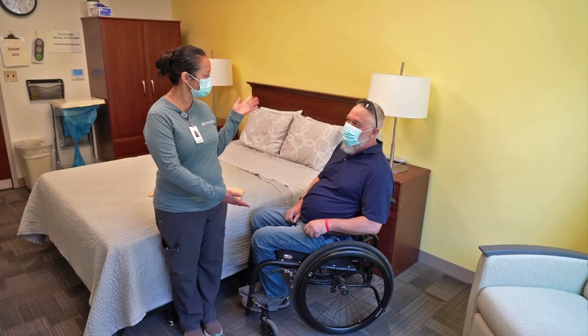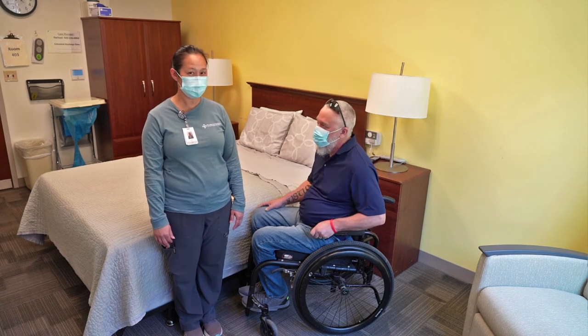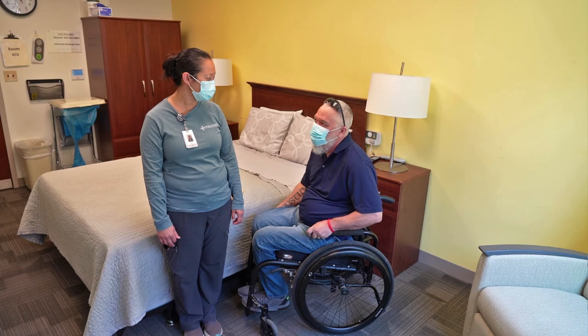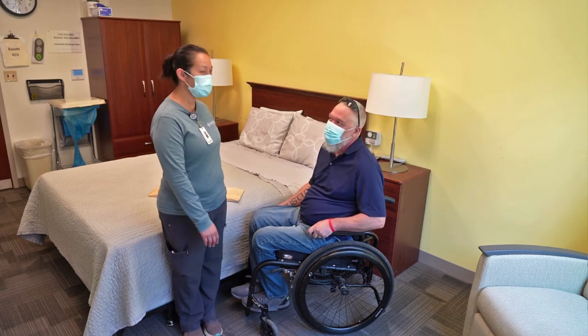We are here with Tim Christensen, who is a former patient here who had a spinal cord injury in November of 2020. He's going to show us how to complete a slide board transfer from the wheelchair to the bed.